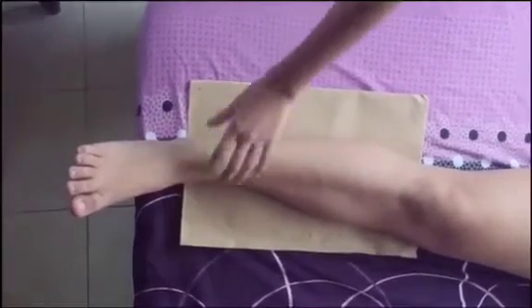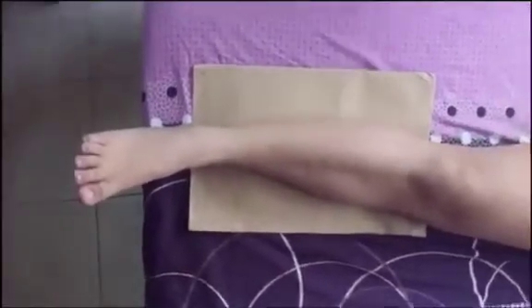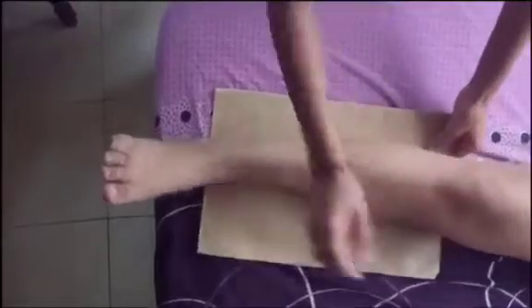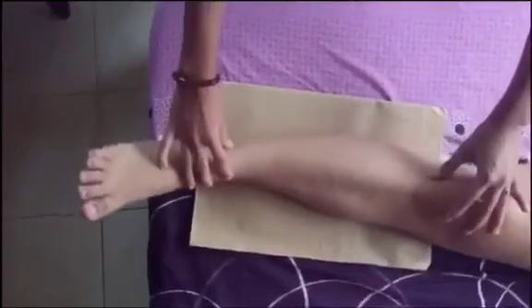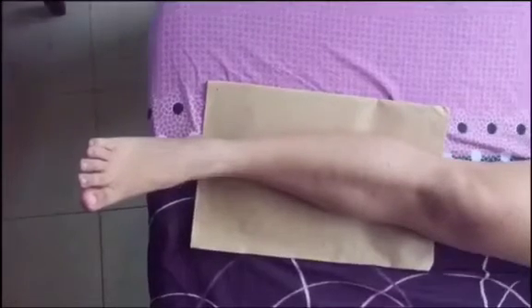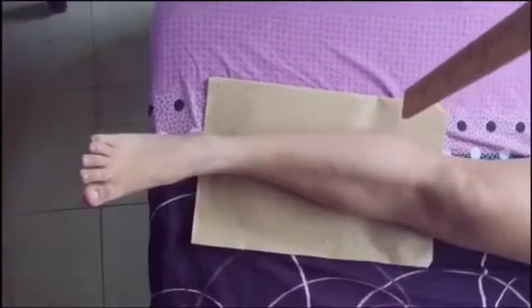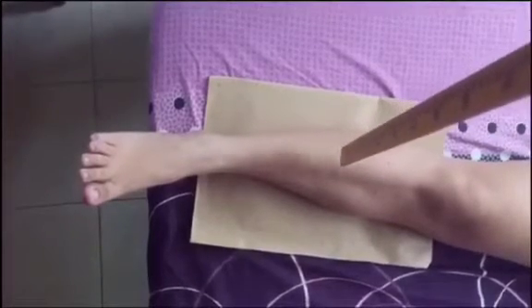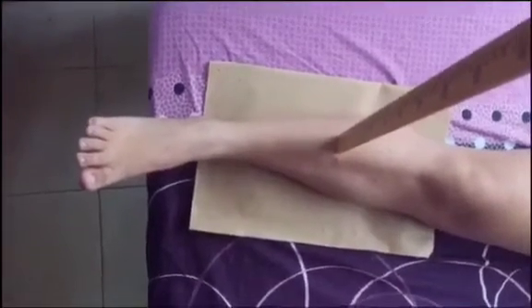Flex the ankle until the foot is in the vertical position. If necessary, place a sandbag against the plantar surface of the foot to immobilize it in the correct position. The central ray is perpendicular to the center of the leg.